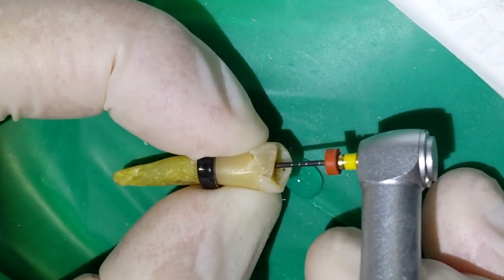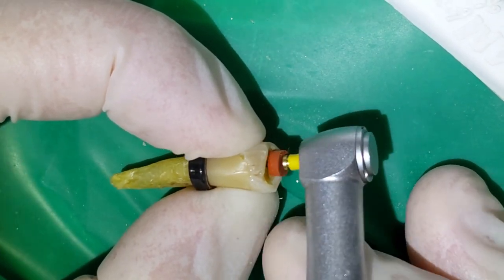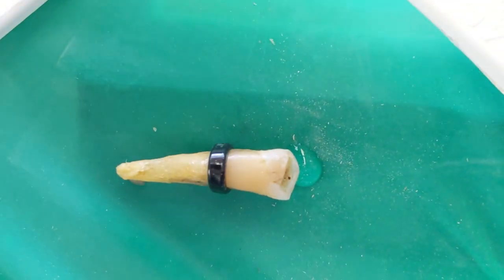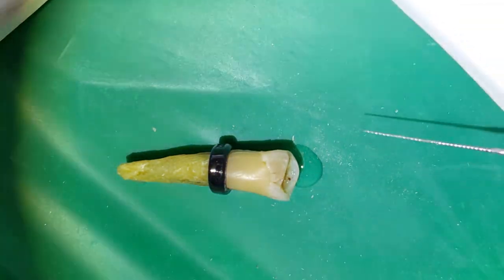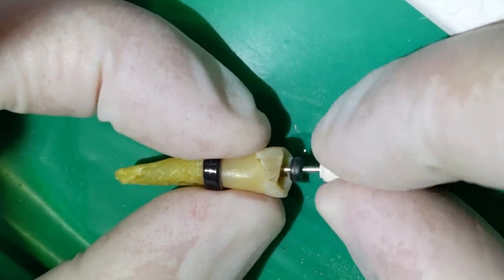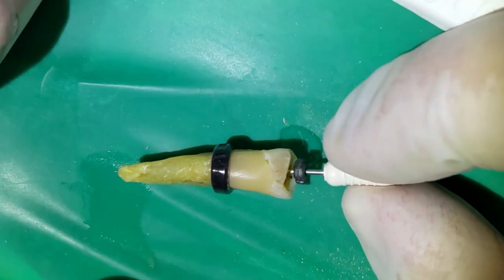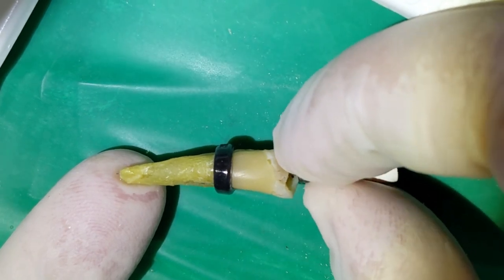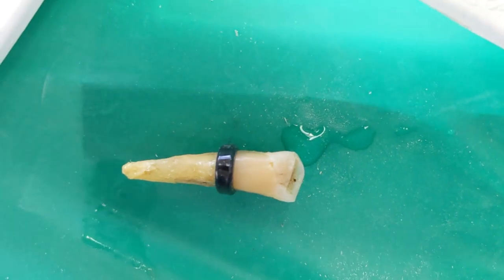There, it's easier to get down to full length with the number 20 file now. So again, from time to time, I'll also take my initial files to make sure I can get it past that length, because you don't want to plug up that hole. You don't want to clean and shape past it, but you don't want to plug it up. There you can see the tip of the file coming out the root tip. Good. So we're not plugged up yet.